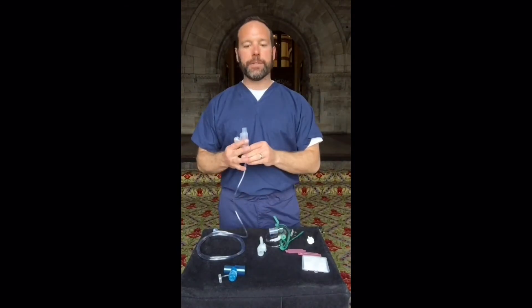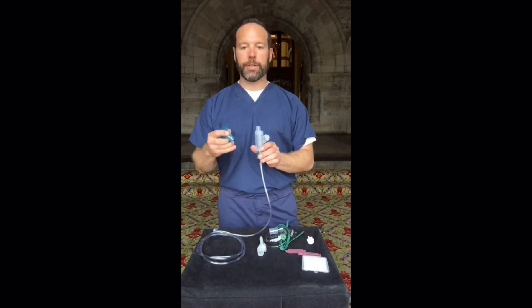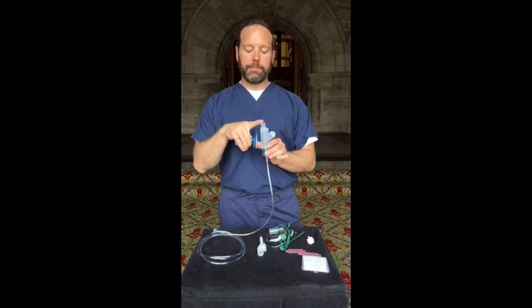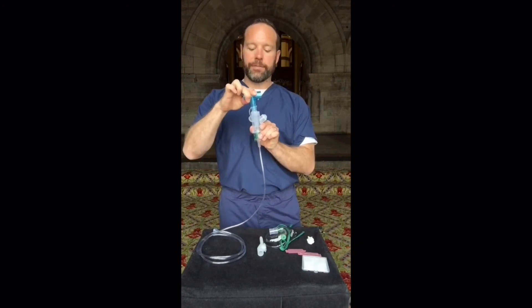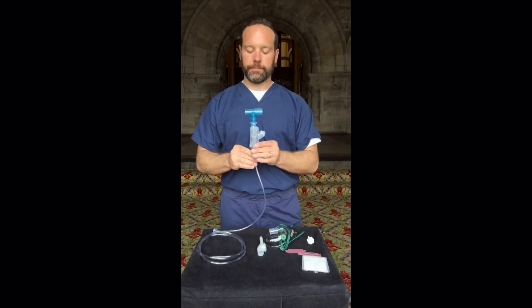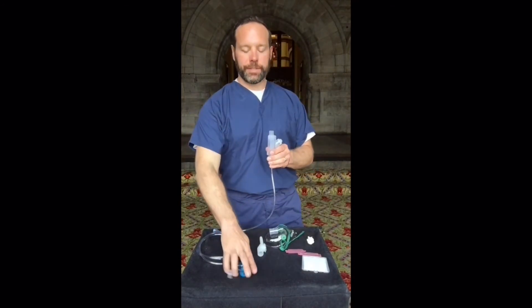If you need to adapt the Nebutek to a BiPAP or a closed circuit of some sort with a spring T adapter, keep the mask adapter on the top of the Nebutek and engage the valve on the spring-loaded T. This can be done in either the top or side positions of the Nebutek.